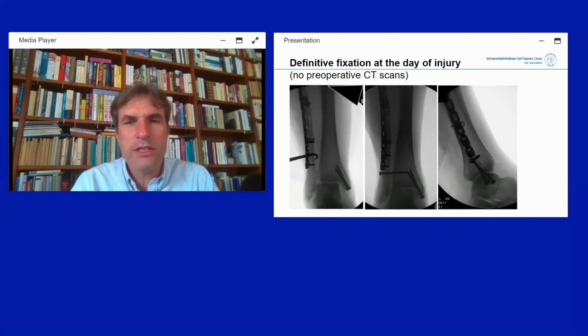The fibular fracture was fixed with a rather long plate and some cerclage wires because it was multifragmentary. The medial malleolus was fixed, and then the syndesmosis was fixed with a screw. The anterolateral part of the ankle was not exposed during surgery, so the surgeons were quite positive that they had fixed the fibula in the correct position.